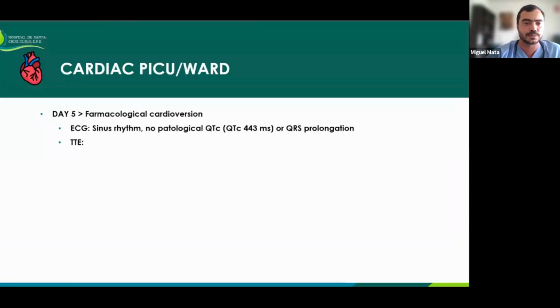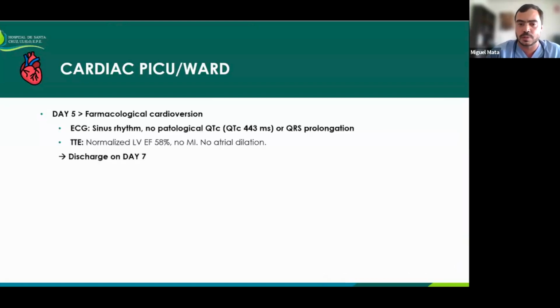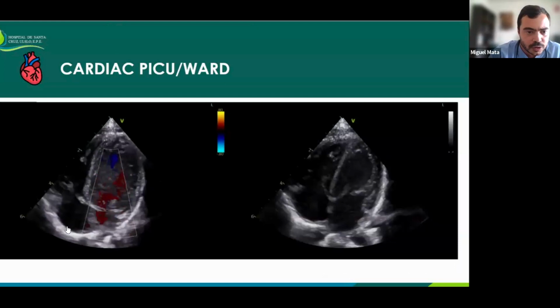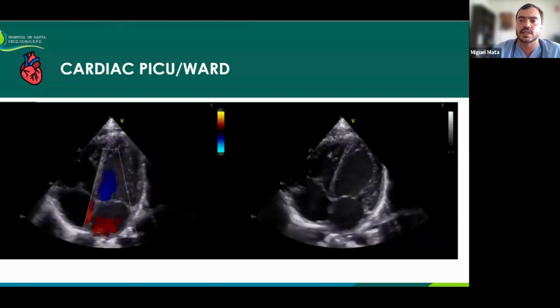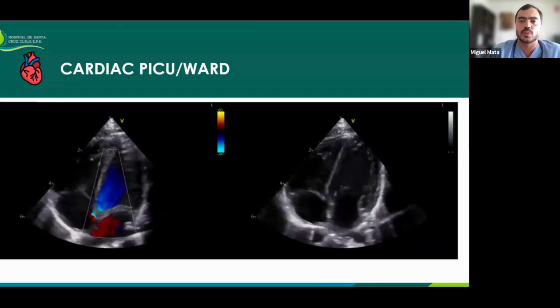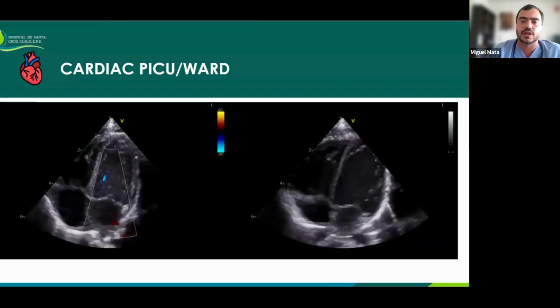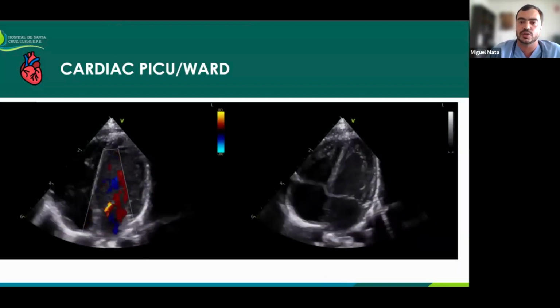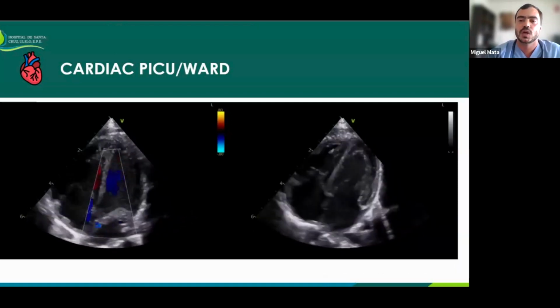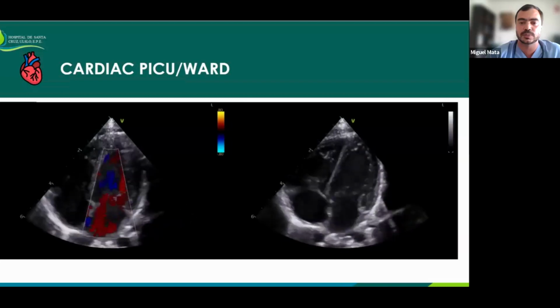can see. And after a while, the echocardiogram already showed great improvements. Sorry, I'm not sure it's okay, playing both. So you can see that there's a normalization of the AV synchrony. There's quite an improvement in terms of atrial dilation and also in terms of mitral insufficiency. And there was also normalization of the left ventricle ejection function.